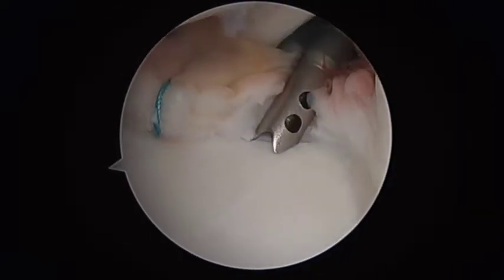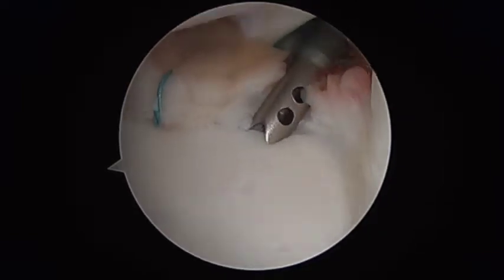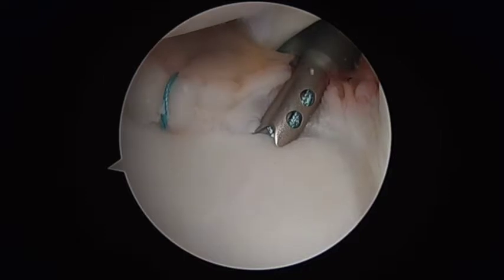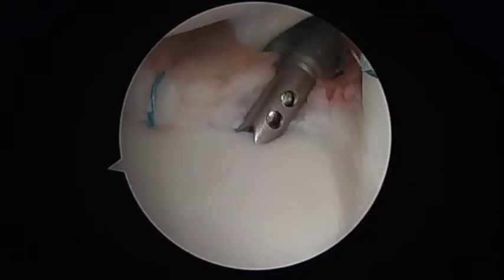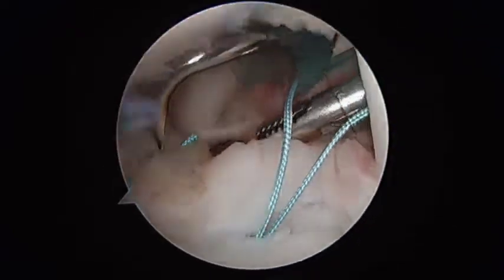The arm was taken down and a repeat examination under anesthesia was performed. The shoulder was now stable to load and shift testing in all directions, including anterior, superior, anterior middle, anterior inferior, and posteriorly.